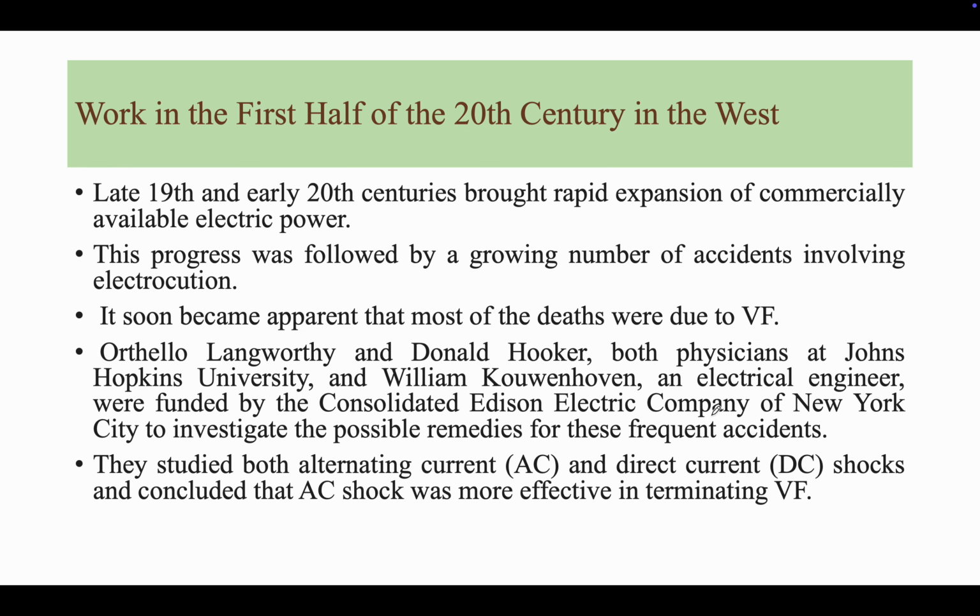So what happened in the first half of the 20th century in the West? As they developed, there was a rapid expansion of commercially available electrical power, but accidents also grew because of it. They found that the death was due to ventricular fibrillation, so they studied how to prevent this death. They found that if we apply current, we can prevent these ventricular fibrillations. Firstly, they found that when AC is applied, it's effective in terminating ventricular fibrillation.